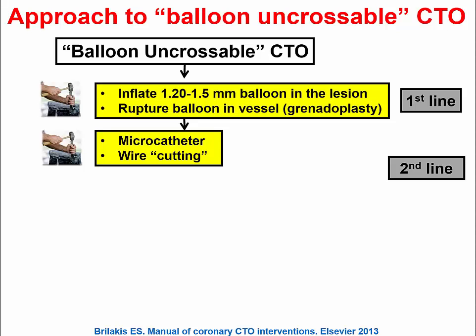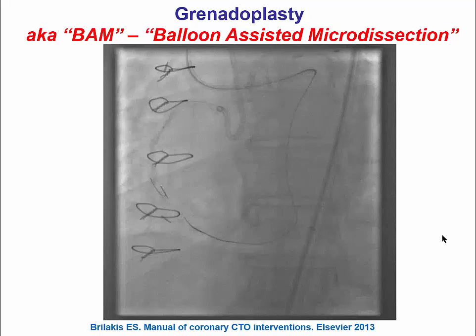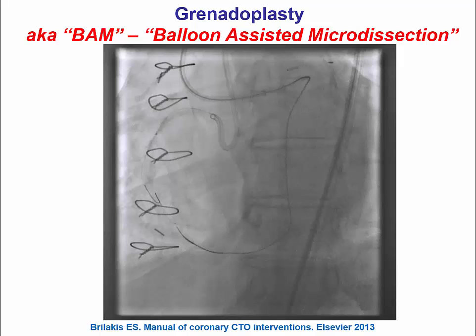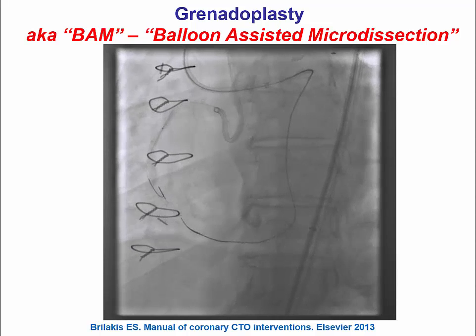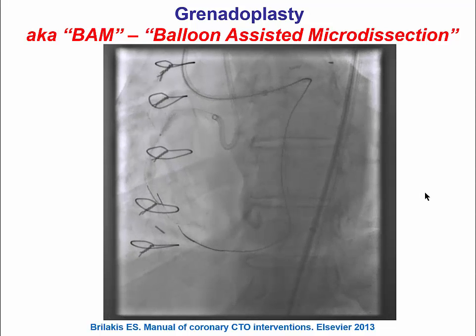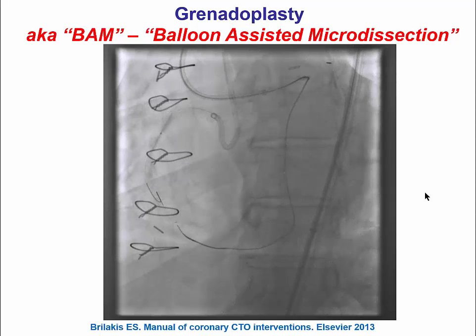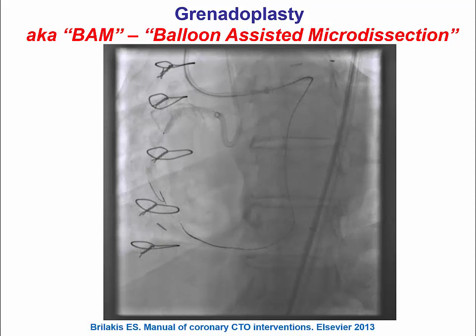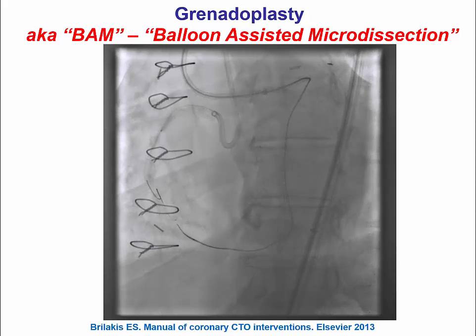If this does not work, the next step is to do what's called grenadoplasty, which is inflating the balloon at high pressure until it ruptures. If that doesn't work, we can try other things like different microcatheters or wire cutting. Here is an example of how grenadoplasty looks: there's a small balloon that cannot cross through a very calcified proximal right coronary artery, and once it ruptures, you see the acute marginals filling with contrast. It's also called BAM, or balloon-assisted microdissection, and although it appears a little barbaric, it's actually fairly safe with very low risk of perforation.